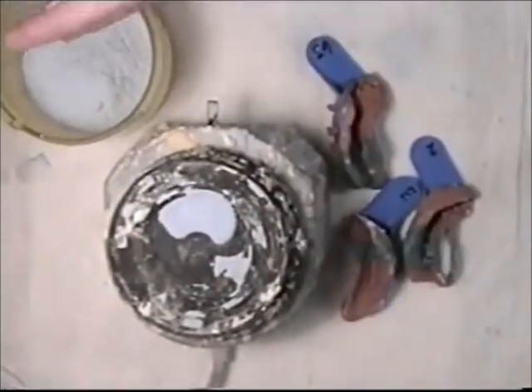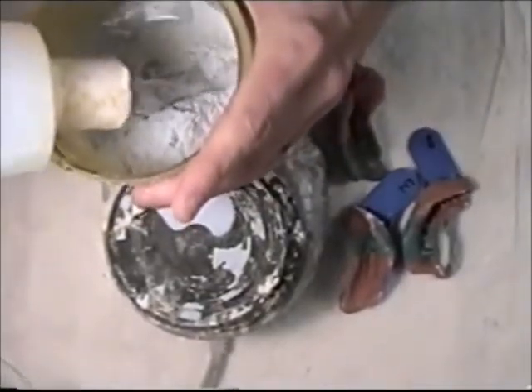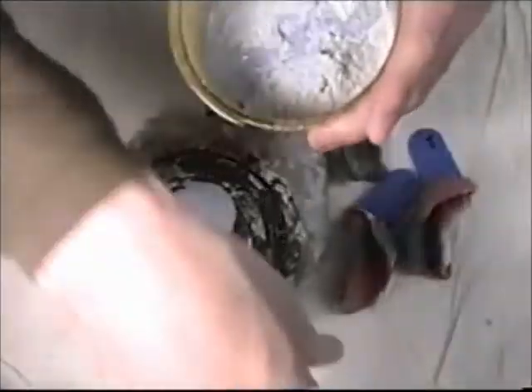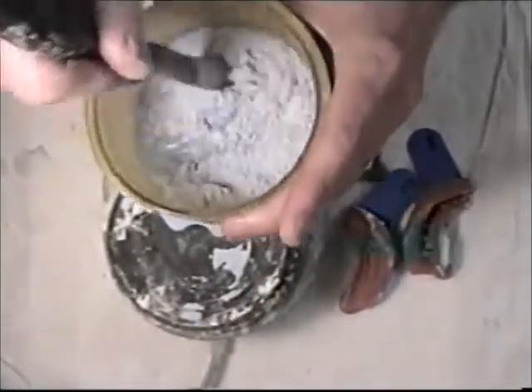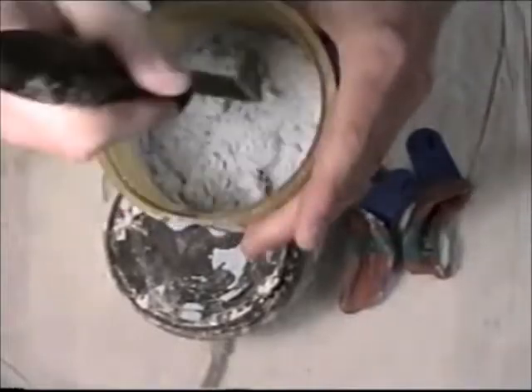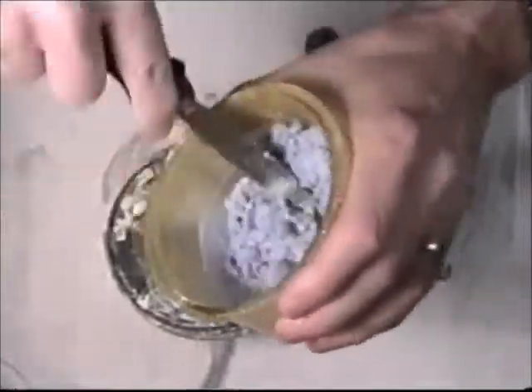I'll be mixing some die hardener liquid into my die stone. I've taken out just enough to pour these impressions up. I'll mix this by hand to begin with.